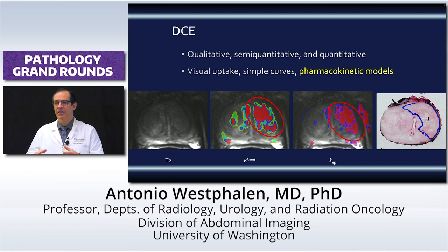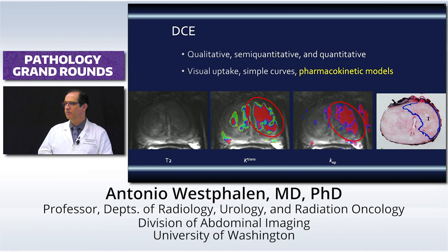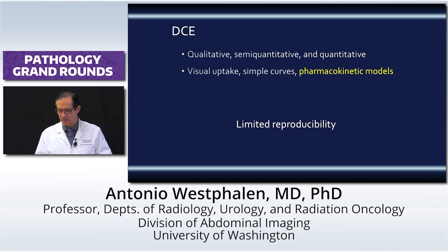place, patients also vary. You have someone that comes with heart failure, and then their cardiac output is already all messed up, and then your image is all messed up, and it doesn't really work. So there's very limited reproducibility, and we don't really use that unless we're doing research.